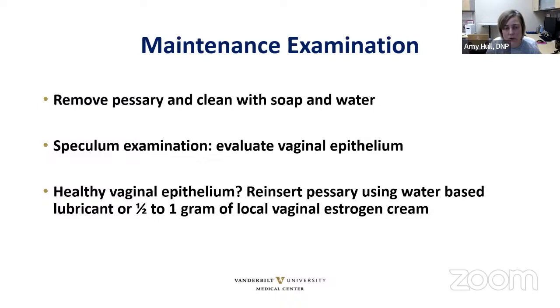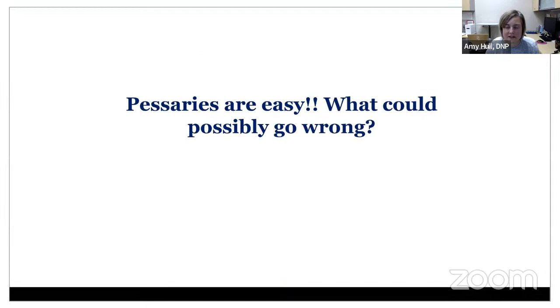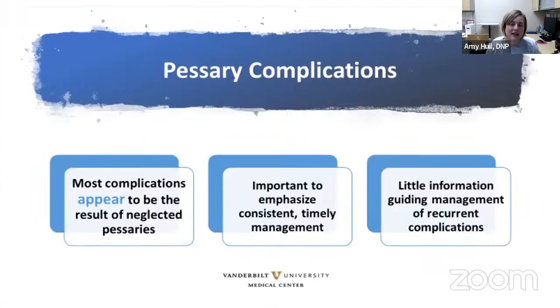So pessaries are easy. So what can possibly go wrong? Lots of things can go wrong, unfortunately. You will see in the literature, if you ever want to take a look at pessary complications, pretty much what we found is that complications occur most often because of a neglected pessary, which is what I mentioned at the beginning of this talk today in my anecdote with that patient from the long-term facility.